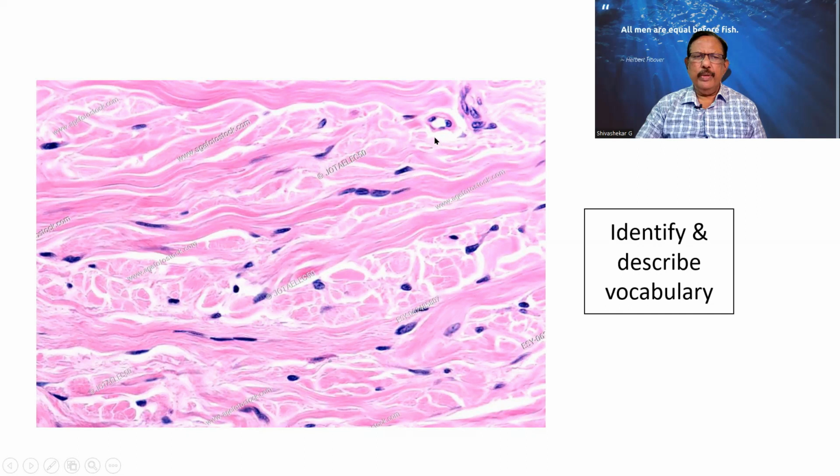There can be a stroma. Look at this person over here: 1, 2, 3 nuclei and a small lumen. So this is a capillary. If there is a single nucleus with a large vacuole, I will think of an adipocyte. So, fibrocollagenous connective tissue. A few capillaries are seen.